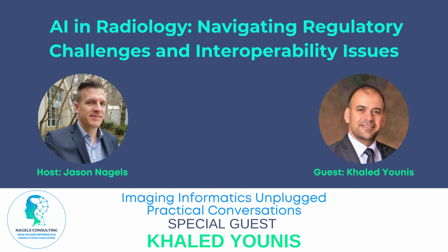So there's still a need for post-market surveillance, and vendors need to show that their system is acting reliably in the market. So, as I said, I believe that there will be more scrutiny now, and the scrutiny maybe not only on the performance, but also on bias and explainability. So the clinical validation maybe needs longer and multi-center trials before approval.